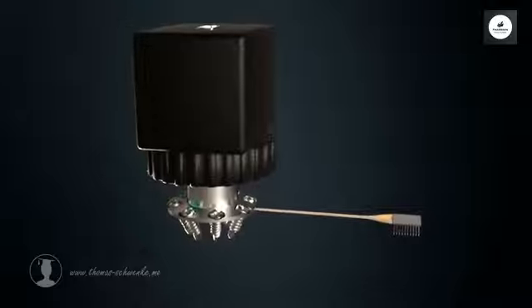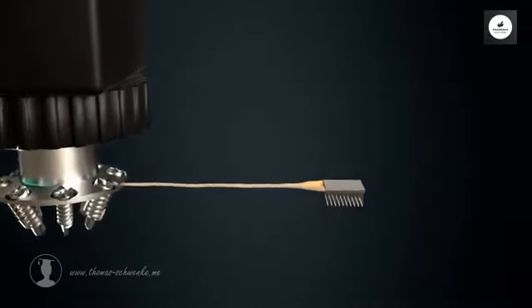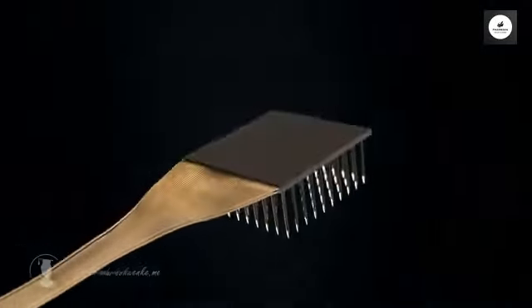Additional wires and electrodes, such as reference electrodes, have been omitted for the sake of simplicity.